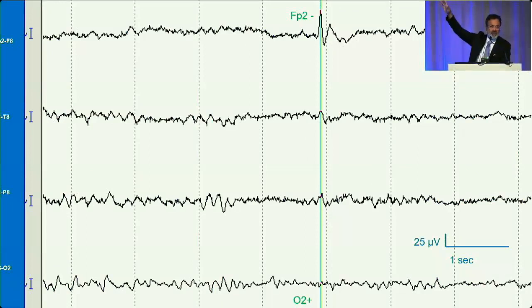It's at the end of the chain. If I told you that the polarity of the event was positive, then it would be O2. Okay? You have to know what the polarity is. And in most situations in epilepsy, the negative polarity event is usually seen in patients with epilepsy.